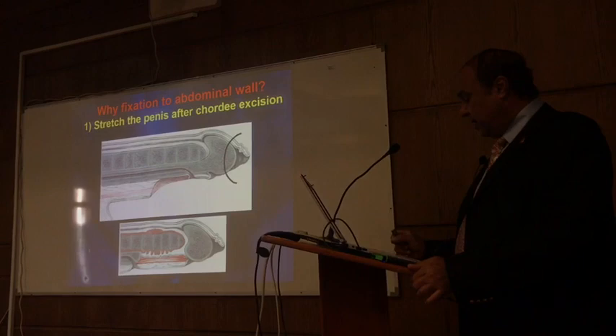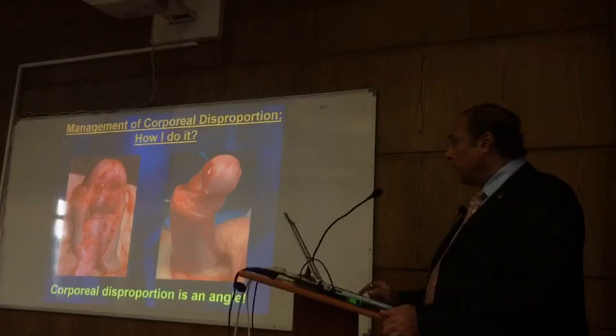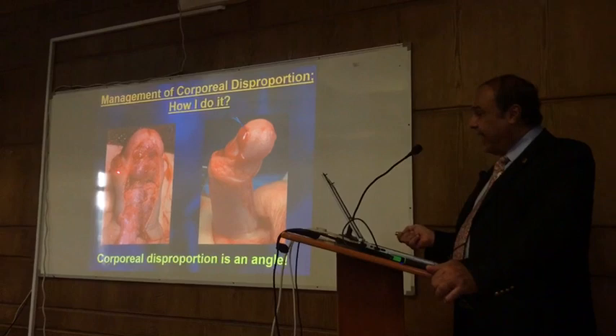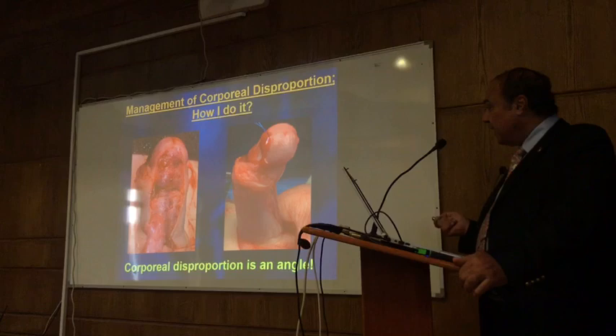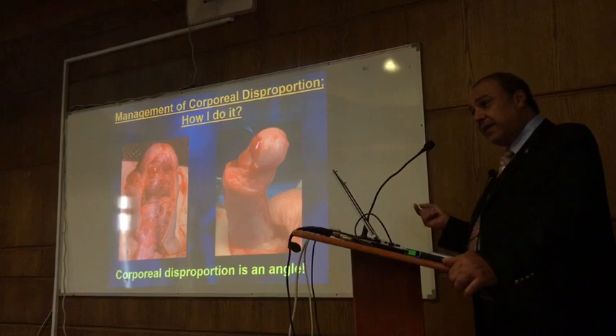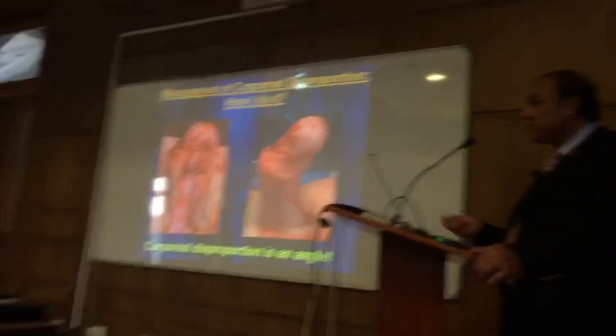Corporeal disproportion is something different. You'll see an angle after you do the TAI technique — like what you see here, it is a clear angle, not a curve. What you need to do in these patients is not three incisions. You do one incision and then you have no tunica albuginea, and then you have to replace it — either with a dermal wrap, or I use tunica vaginalis flap, or I use synthetic material like SIS.